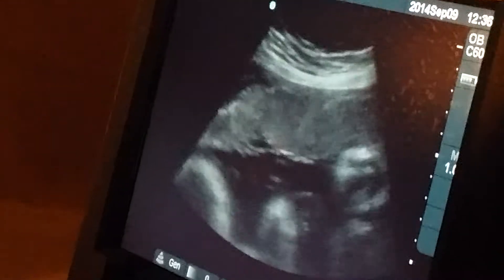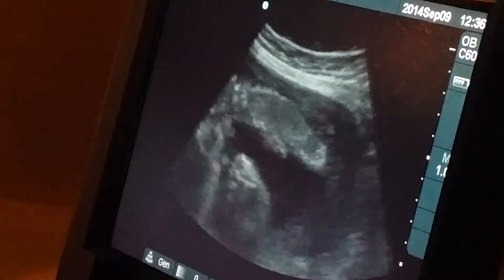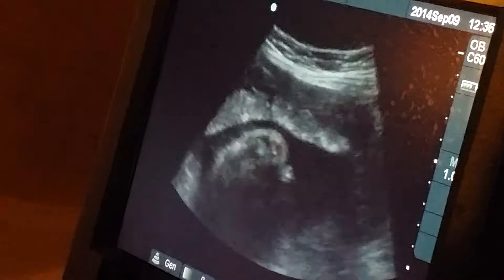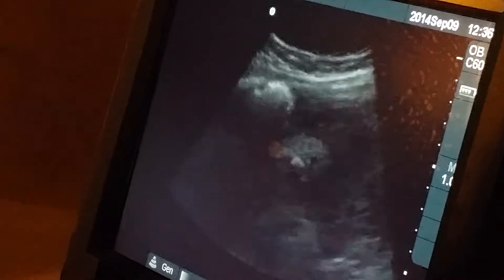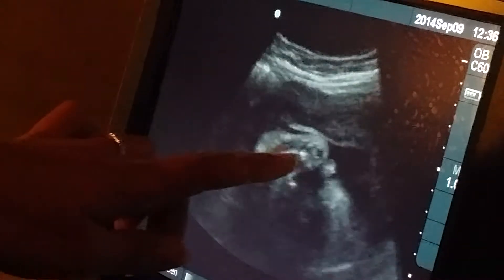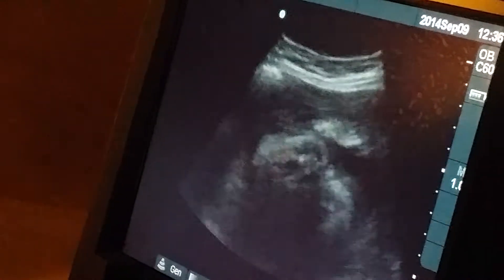And then let's see — lots of little feet and hands right here. And then we got to measure the fluid. Okay, there's a little foot. See all the toes? Little toesies.